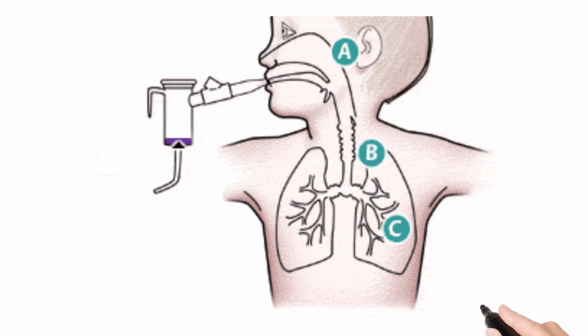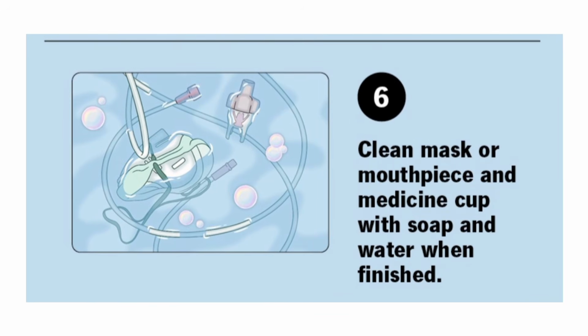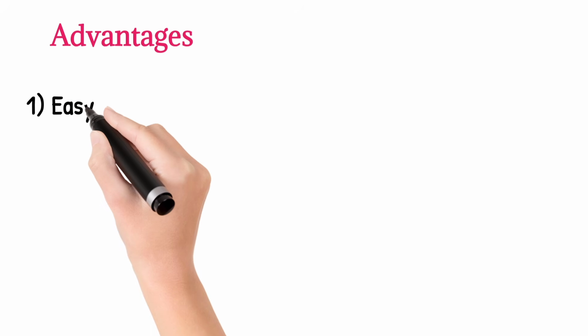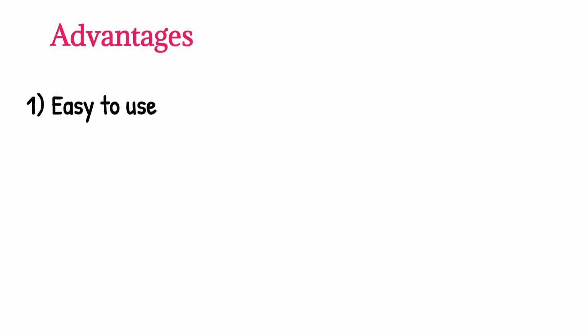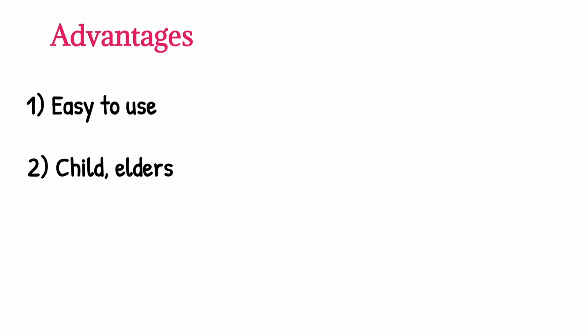After the medication is finished, turn off the machine and clean the components. The advantage of using a nebulizer is that it is easy to use, and for young children and elderly people, where inhaler usage is difficult, it is very helpful.